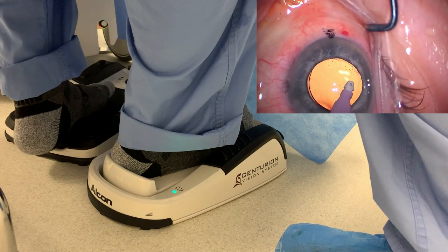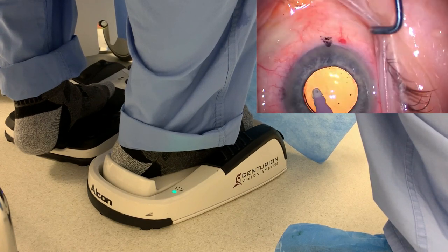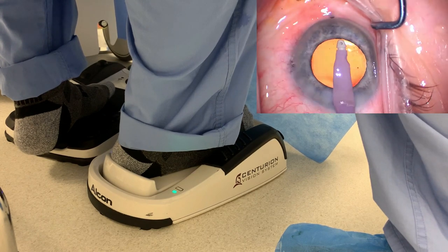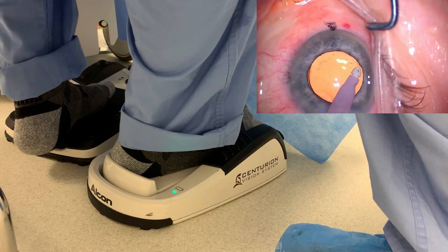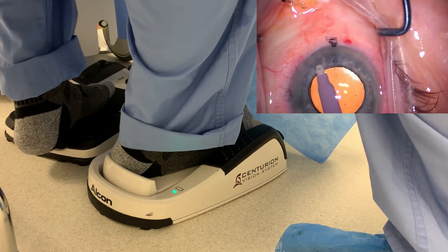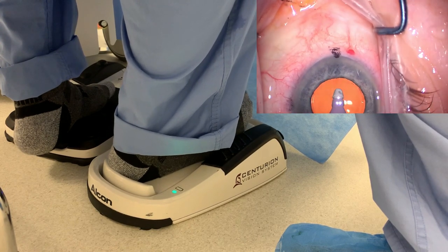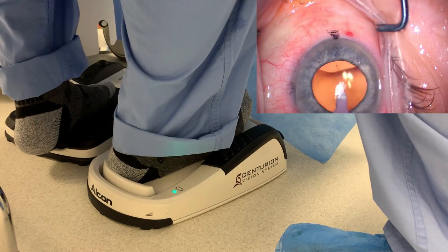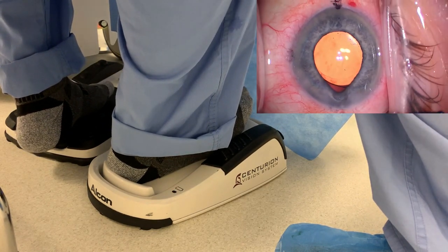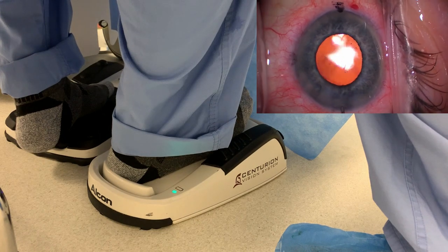I tend to operate, as you see in the video, with just my socks on. I wear surgical clogs which I can kick off at the beginning of the case, and then I operate with just socks. You can certainly operate with shoes if that's your preference, but I feel I have better feel and better control operating with just socks on. That looks great coming out of the eye — let's finish this case up. We'll seal up the incisions and then fix the iris prolapse here.